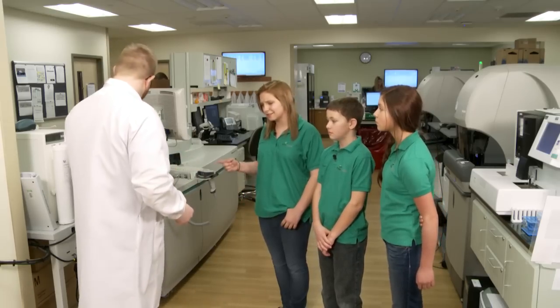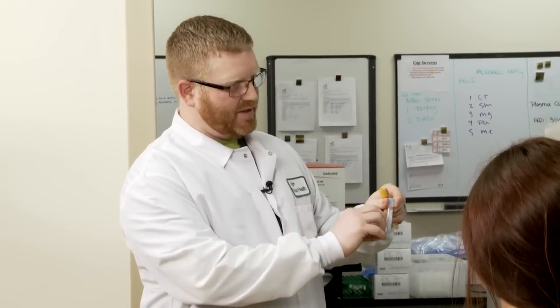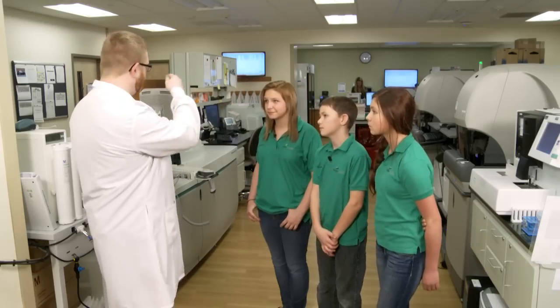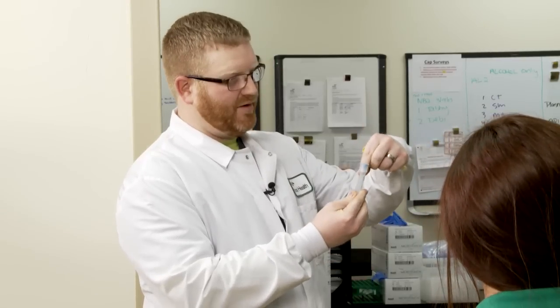How do you keep the cells in the blood from getting mixed up again? The cells are heavier than the liquid part, so when you spin them around, it packs them all in the bottom of the tube and you just have the liquid part at the top. How do you get the liquid out and not the cells? The different machines we have have little probes that will go down in the tube and only take the part that they need.